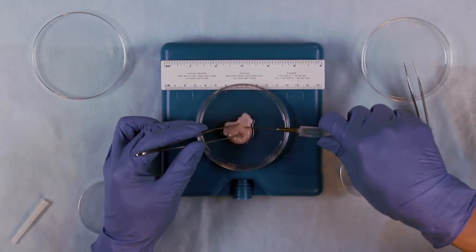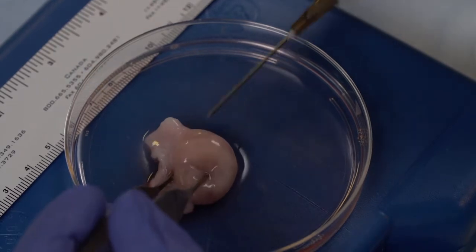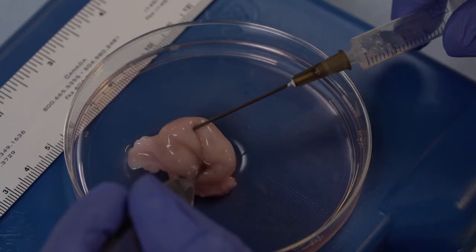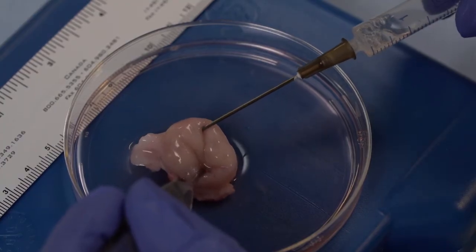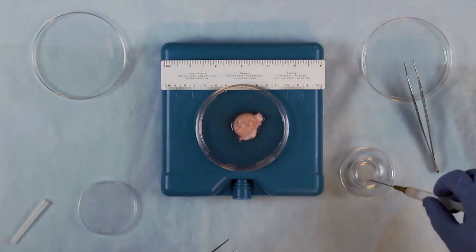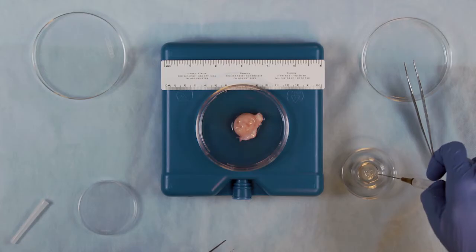There should be some holding media already loaded into the syringe before aspiration. Gently aspirate the follicular fluid from each follicle and eject this media into a petri dish to look for immature oocytes.